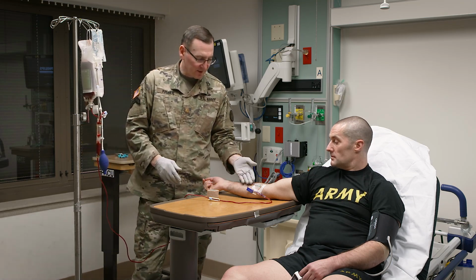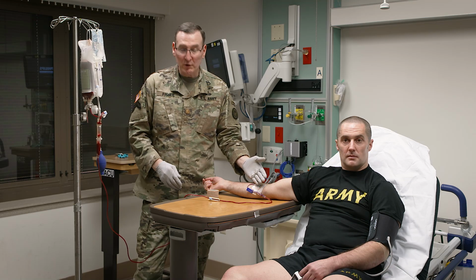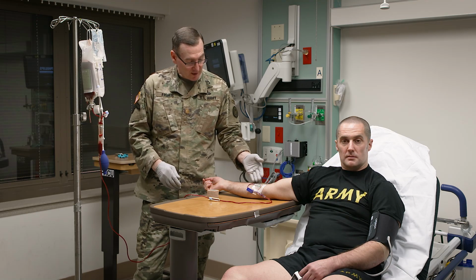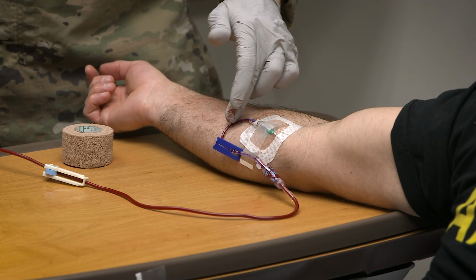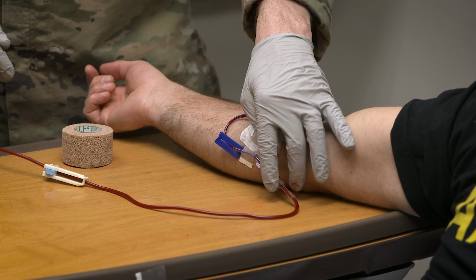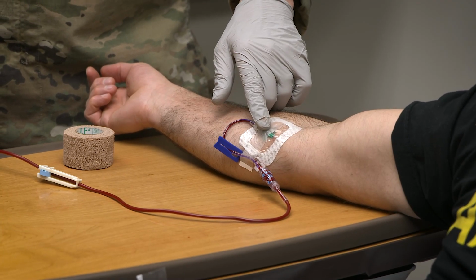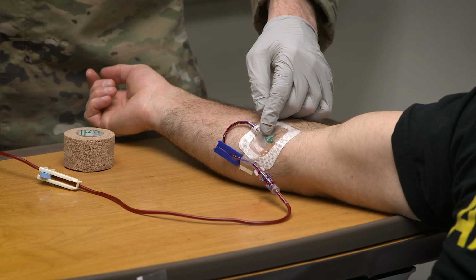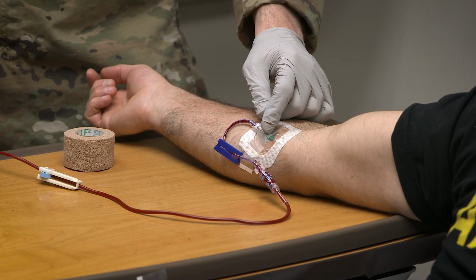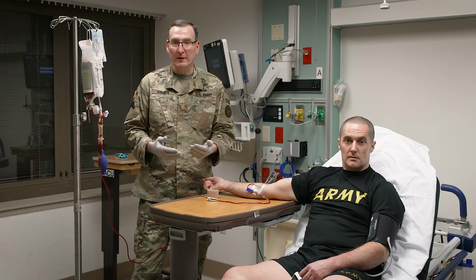Another thing you may want to consider is, if I plan on doing multiple units of blood for my patient, I could consider removing this portion, this extension here, and then just hooking the line directly up to the IV, or I'm sorry, the catheter itself. Or if I have a much shorter saline lock on the back of it, I could hook it up that way. So as we go through, I'm continuing to monitor my patient for any sort of adverse events.